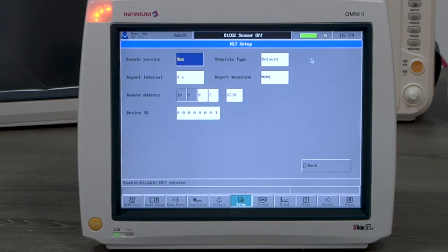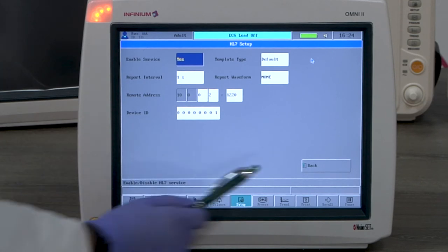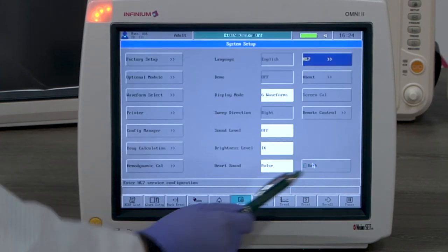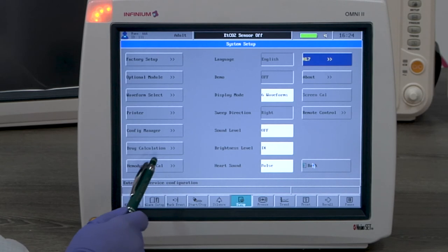HL7 feature is for connecting the monitor to a compatible EMR system. This is a password locked option available upon purchase.